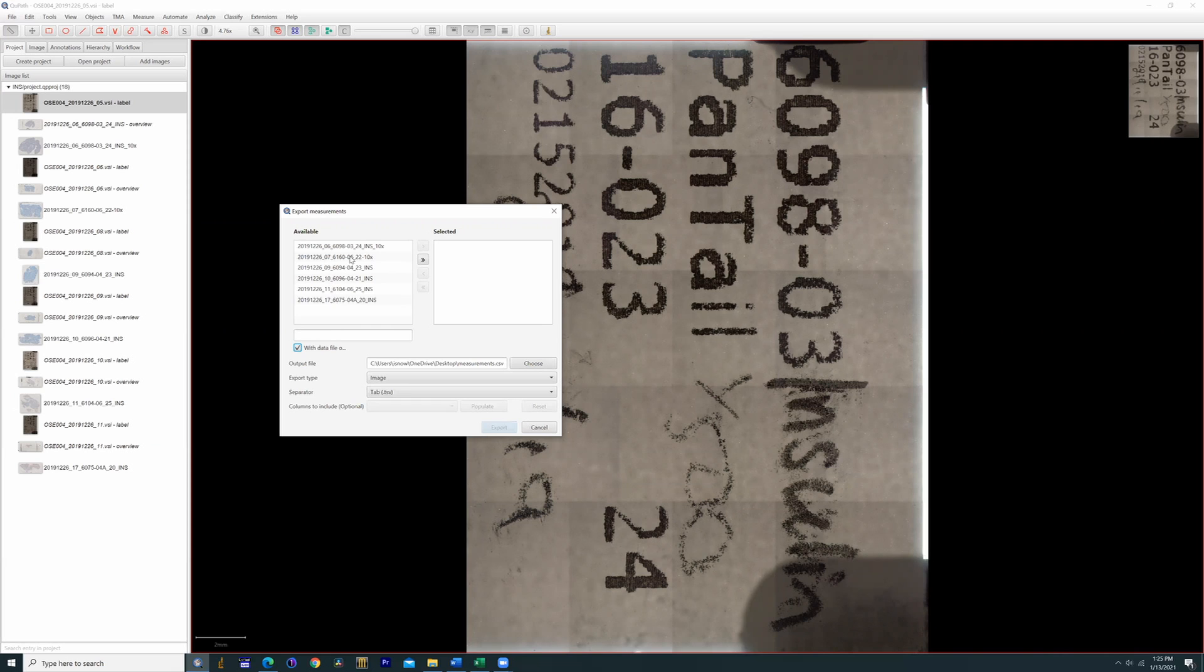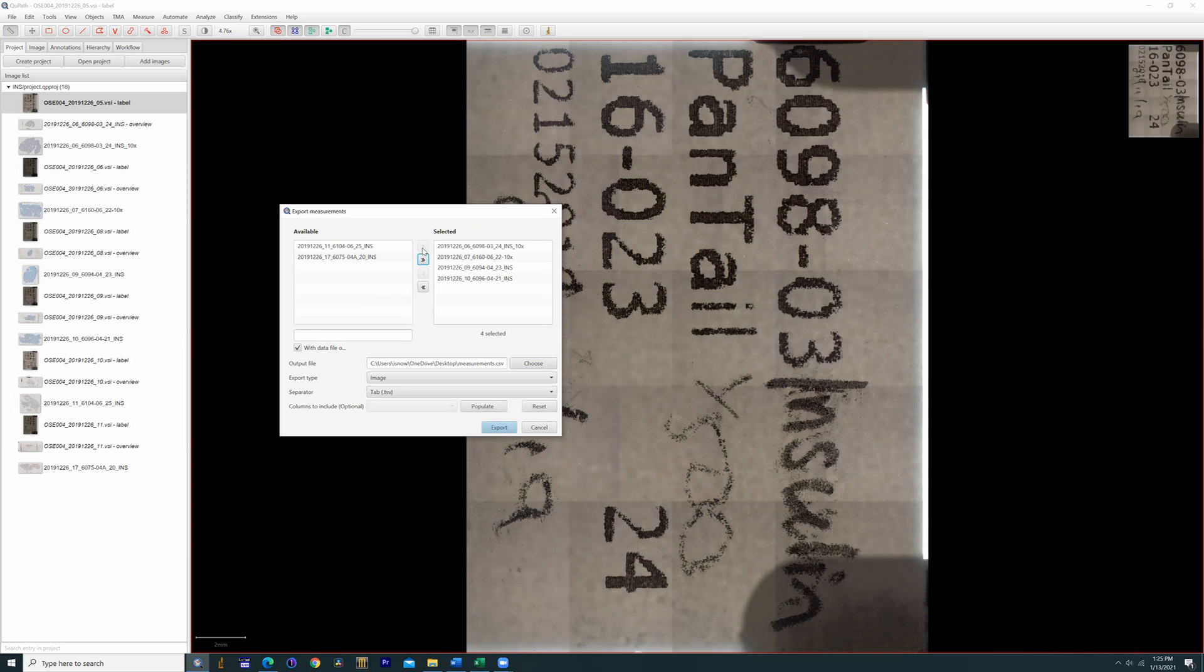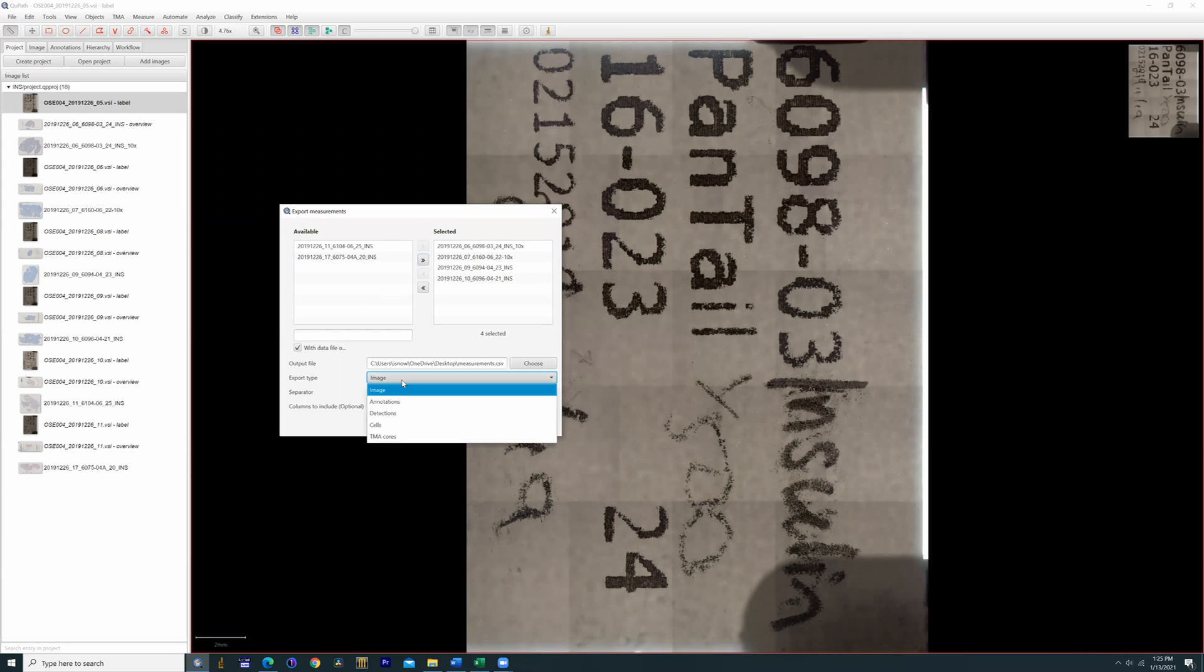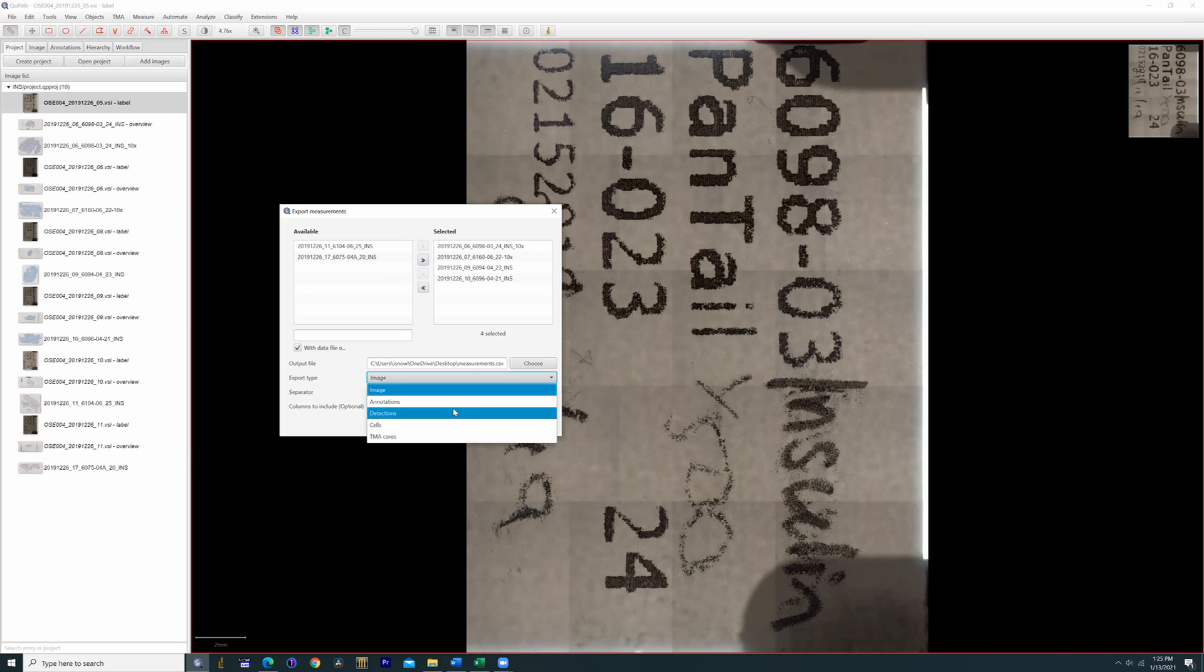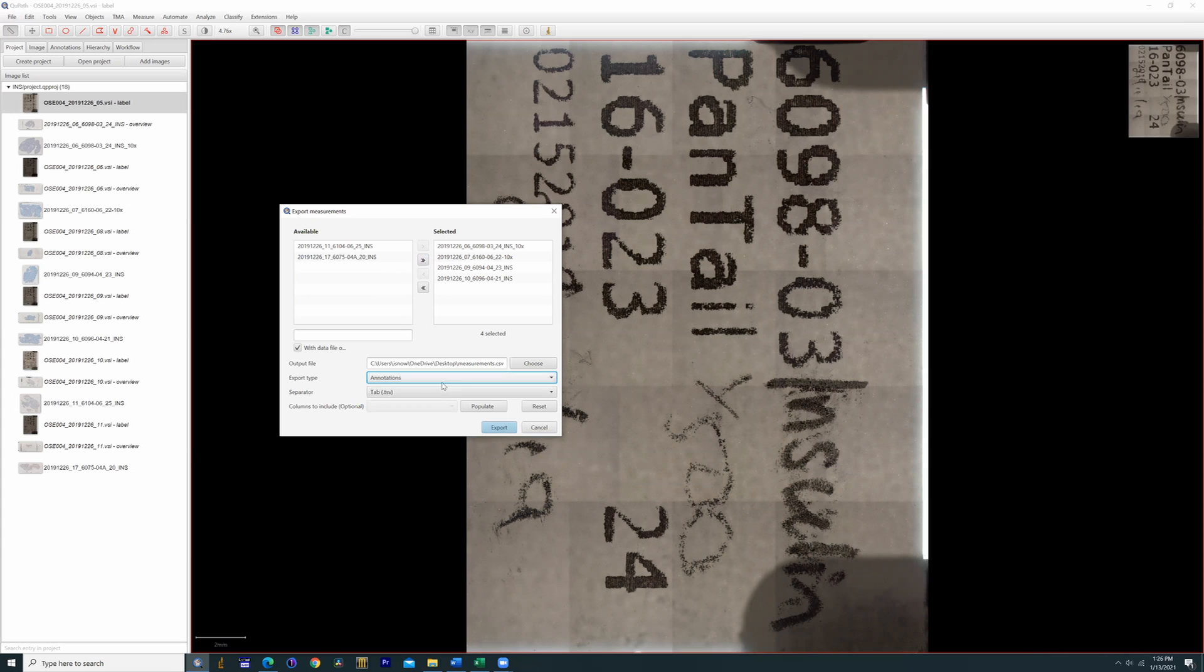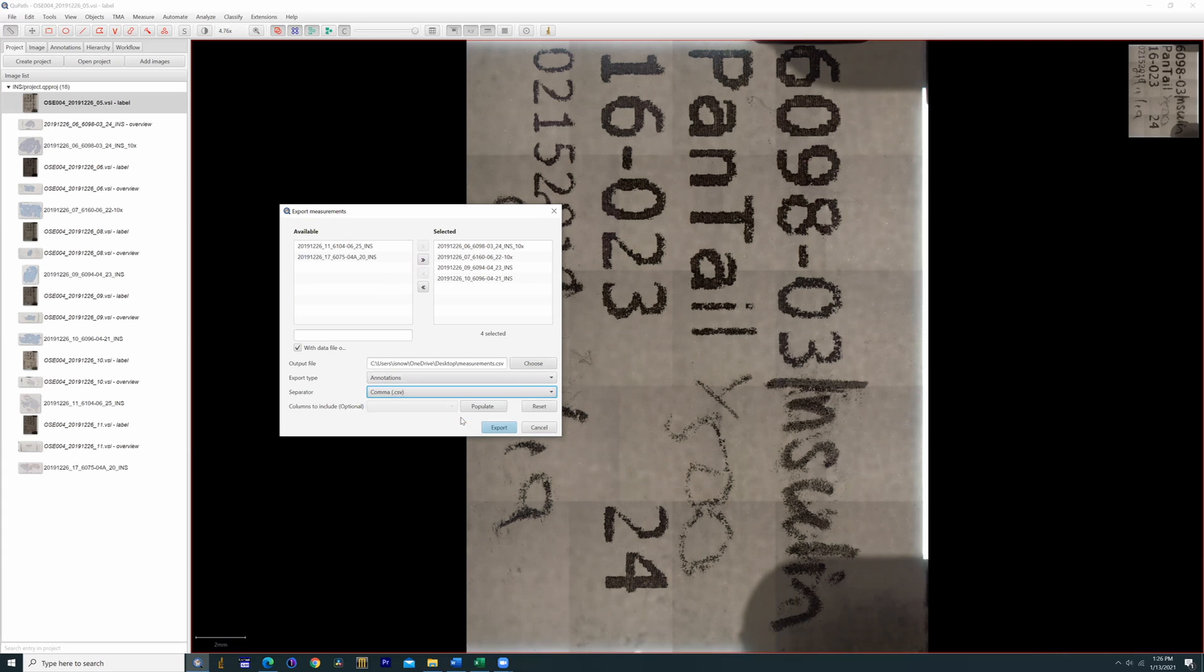And in this case, we'll click on a couple of these. Let's say the first one, the second one, the third one, fourth one, and whatever. And you pick the data set you want. You hit export. There's the files down here. We have several options. You can click on annotations, cell detection cells, TMA cores. For right now, I recommend sticking with annotation because basically this is the individual accounts within the file. And I recommend using the CSV format if you want to use Excel.